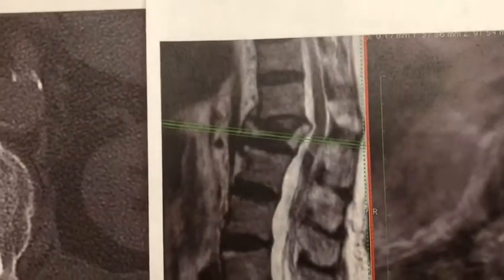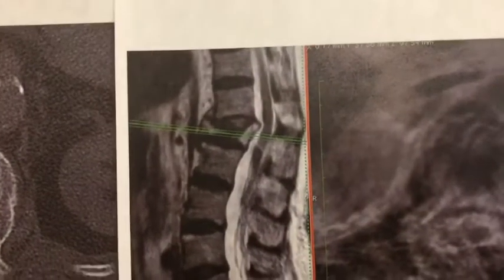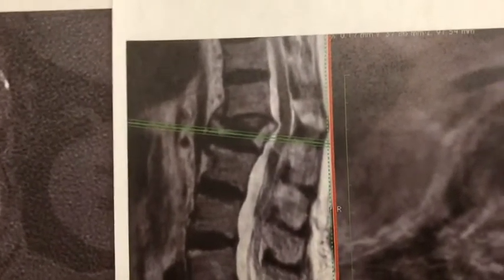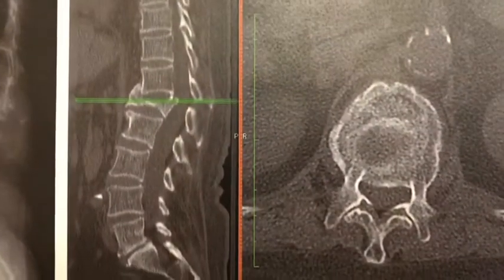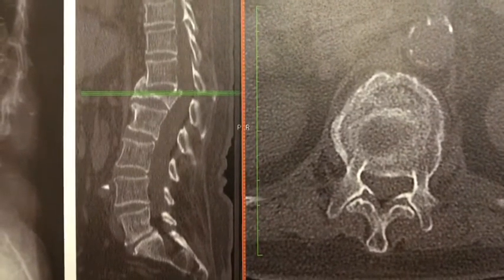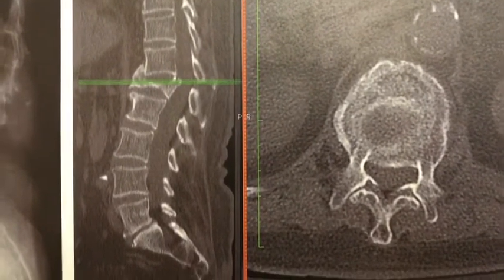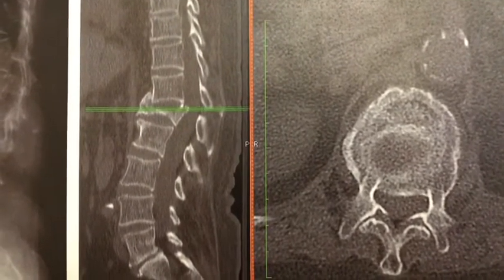Although there's not direct cord compression, she's lying down here and she cannot walk due to severe pain. You can see this little corner of bone is threatening the spinal cord there. This is at L1, and the standard open surgery would require a large thoracoabdominal approach, which includes getting into the chest cavity as well as the abdominal cavity.